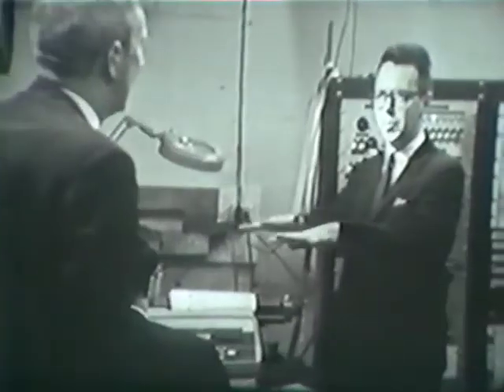And we're working on other outputs, such as a tactile display, a sort of a slow-speed tactile TV, which can lay out pictures and diagrams and other material that a blind person couldn't get from a recognition system. So you'd actually feel the outlines of a picture. Yes.